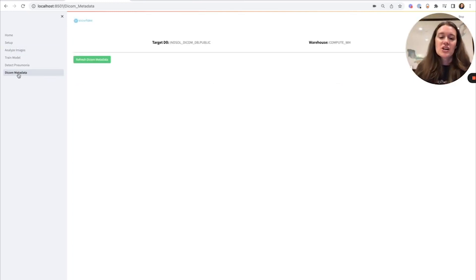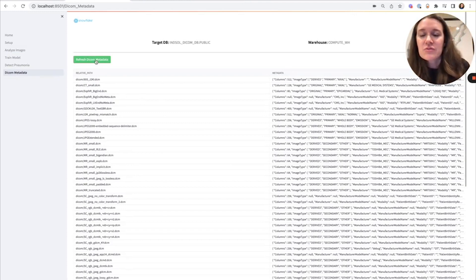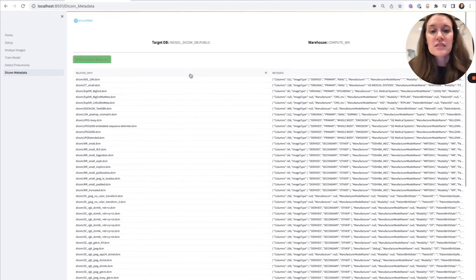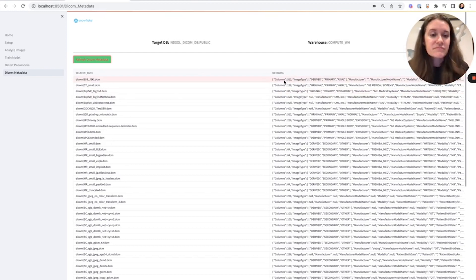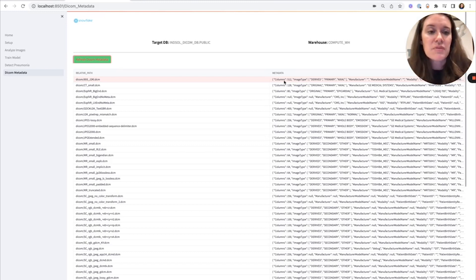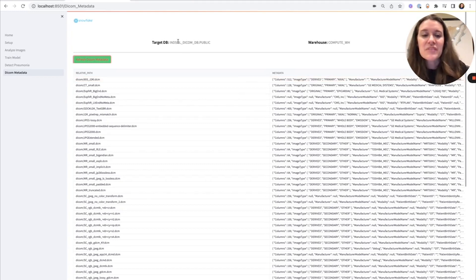First, I want to show our DICOM metadata. Every time I click refresh, I'm going to that external stage, checking to see if there are any new images, and then running the PyDICOM library to parse that metadata and write it into Snowflake. You can see that the metadata comes in in its raw form as JSON, which I have saved as a variant column. If I wanted to, I could create a view on top of this to have it look more like columnar data. But using Snowflake's JSON capability, I can query even this variant column directly.